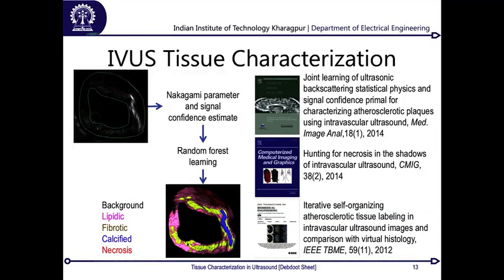So what we make use of is again a pyramidal decomposition framework. We start by assuming that there is some homogeneity at a scale. Say, starting with a small neighborhood of 3 cross 3, then we expand this neighborhood to 5 cross 5, 7 cross 7, 11 cross 11, and keep on going. As you keep expanding, say at 3 cross 3 it is homogeneous, and at 11 cross 11 it is homogeneous, then obviously at 7 cross 7, a lower scale, it is also homogeneous, and any of the lower scales will always be homogeneous. That is how it is supposed to be.